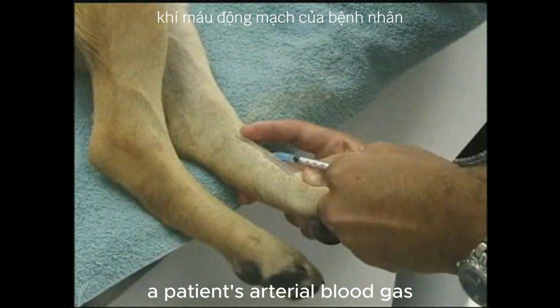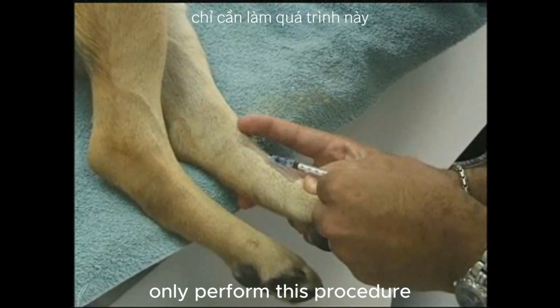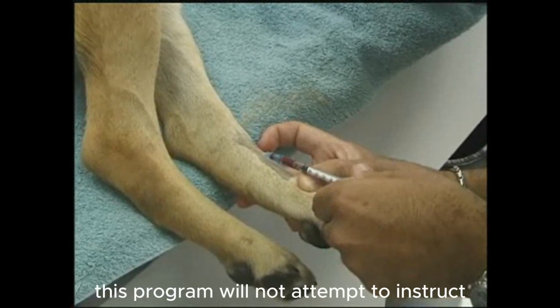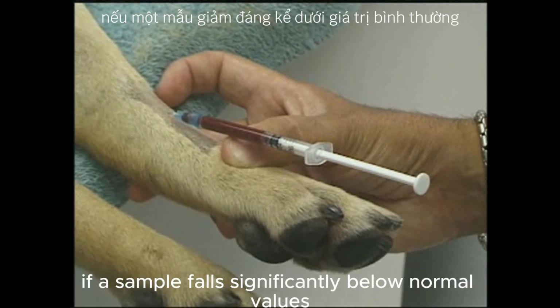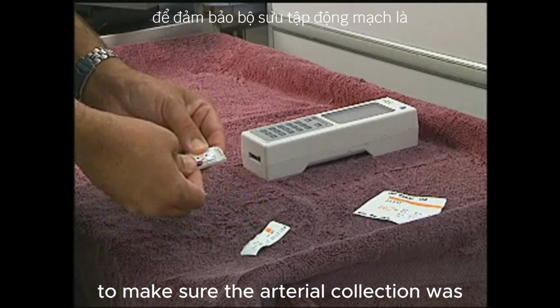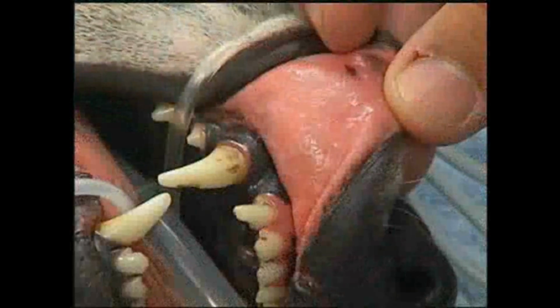A patient's arterial blood gas can also be evaluated for oxygen levels. Only perform this procedure if you are proficient with arterial blood collection. This program will not attempt to instruct you on the technique for collecting these samples. If a sample falls significantly below normal values, it should be compared to a venous sample to make sure the arterial collection was not inadvertently mixed with venous blood.